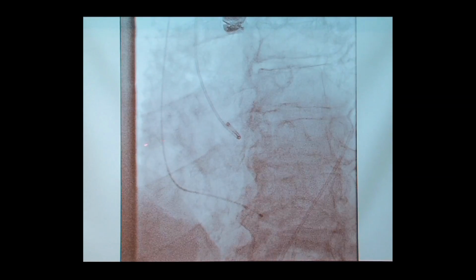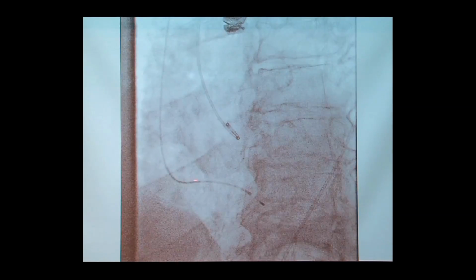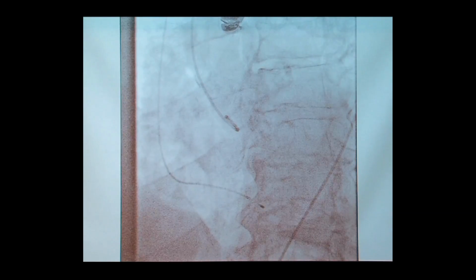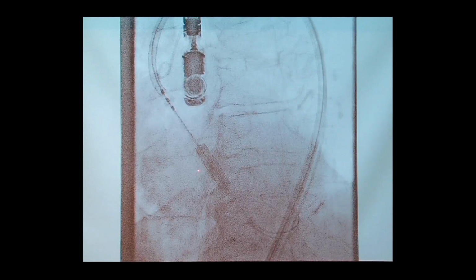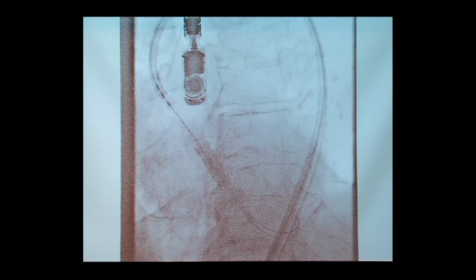And what we do is we get an angiogram from the other side that shows the aortic valve. Those are all the coronary arteries, as you can see. There's the temporary pacemaker wire, which we will use when we deploy the valve. So essentially, we're going ahead with the system, and we have the valve in the right position here, and we're going to rapidly pace the heart, as you can see, and slowly deploy this valve.